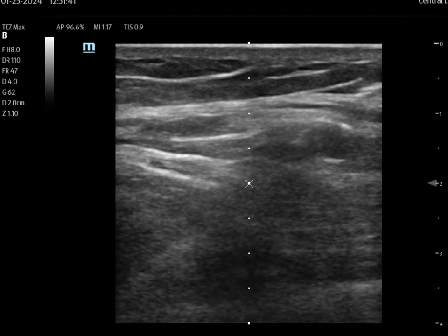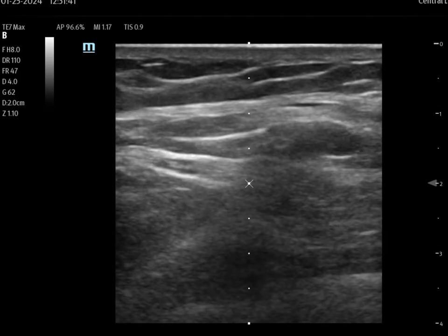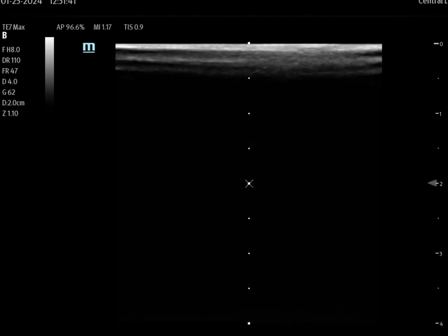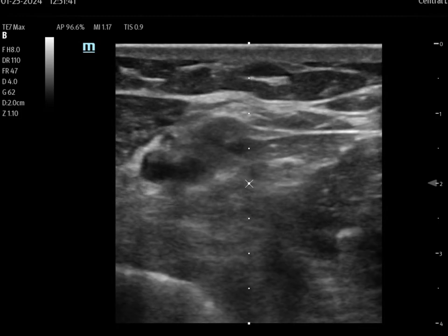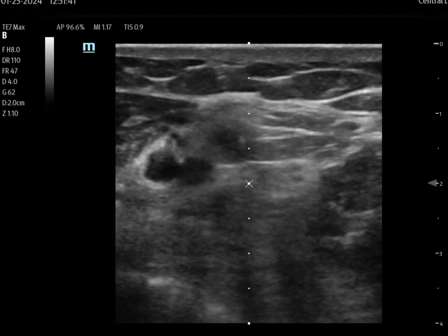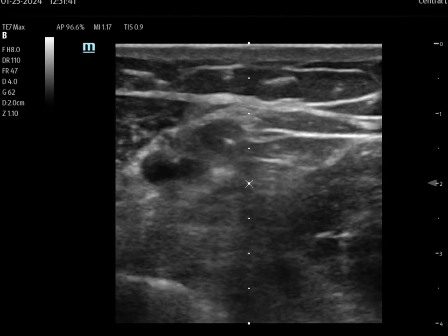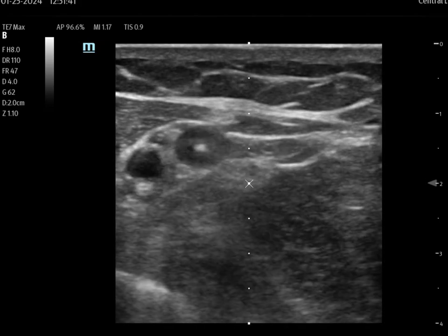In this clip, I was having difficulty using short axis, so I went longitudinal, which was no help either. The reason was a bifurcation where the basilic and brachial vein meet. In these situations, you have to slide your probe back and forth and orient your needle toward the direction of bifurcation. As you see here, I orient my needle tip to the left of the vessel, and right there I've entered the brachial vein.